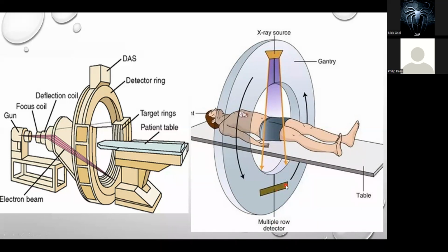If you want to take helical shots or axial slices, all you do is that the machine just rotates. If the patient is still and the machine is rotating around the person, at various points you get various angles, a 360-degree angle of any particular point in the body. So those are the helical ones. The newer ones are like that, and they give us 3D imaging.